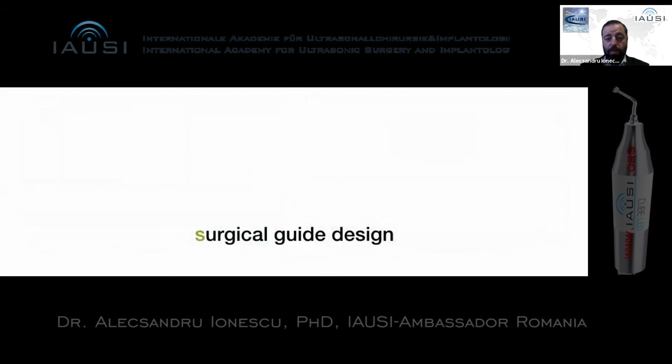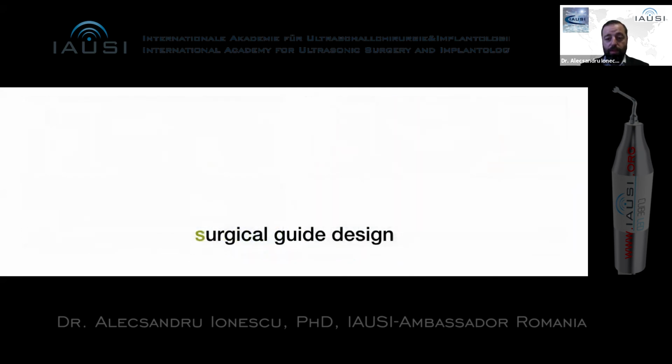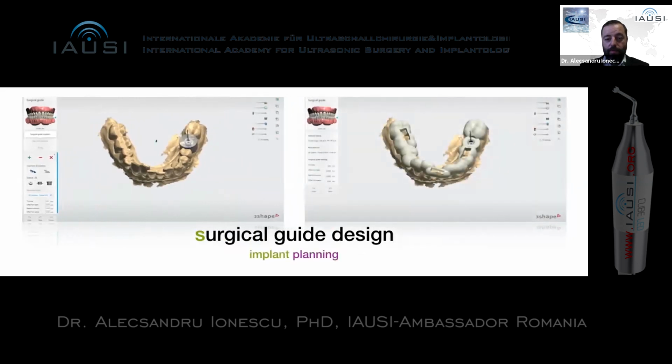You can see in this case the patient came to us with a tooth already extracted, and you can see that the crest is quite narrow, and we had to do some mixed bone spreading in order to be able to solve the case in a minimally invasive way.